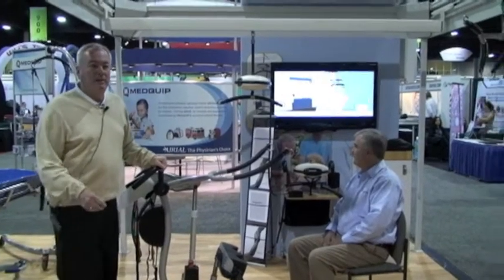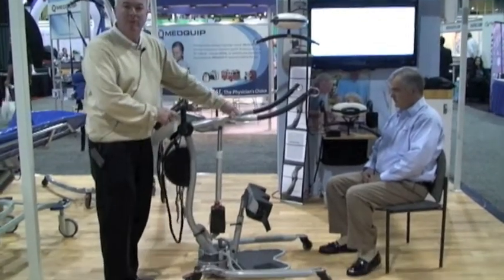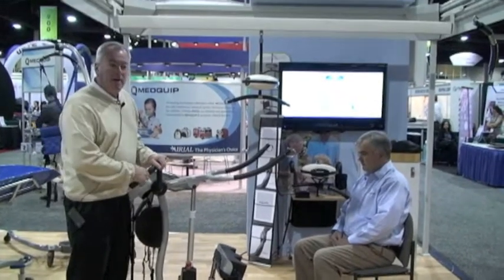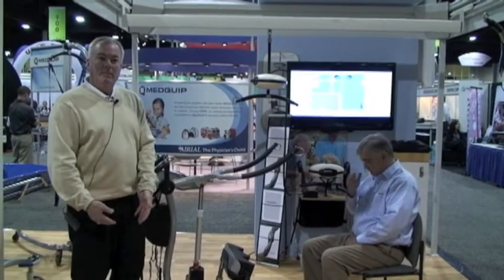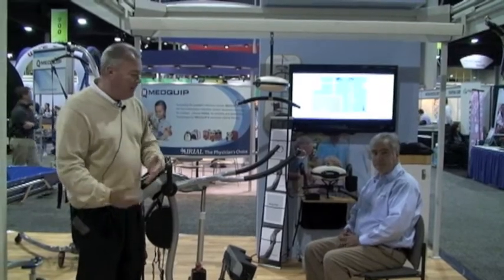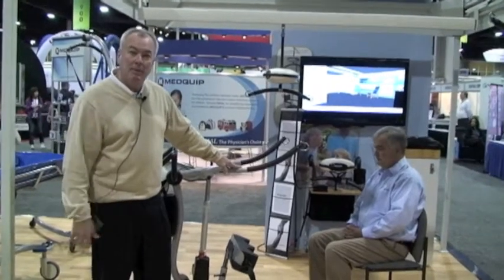One of our featured products is our sit-to-stand lift called the STOA. This particular piece of equipment is used for residents or patients who can weight bear. It's also used for bringing patients over for toileting, and to get people up in a standing position to get their blood flow going. The weight capacity on this lift is 330 pounds, so we can stand anybody up that's 330 pounds.